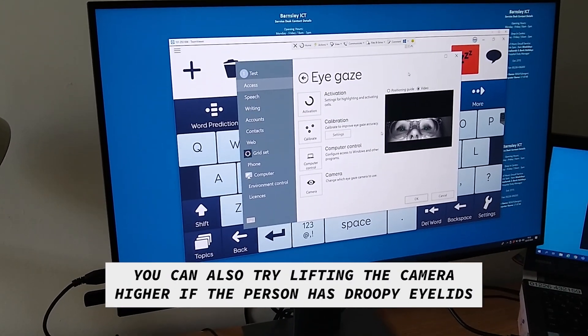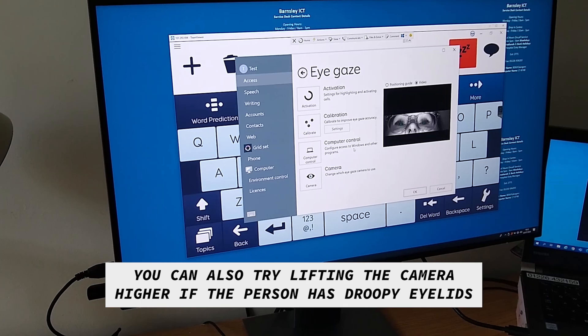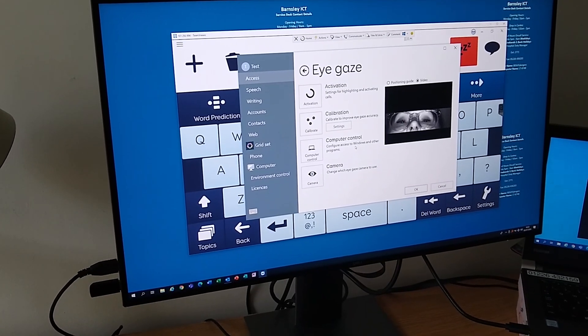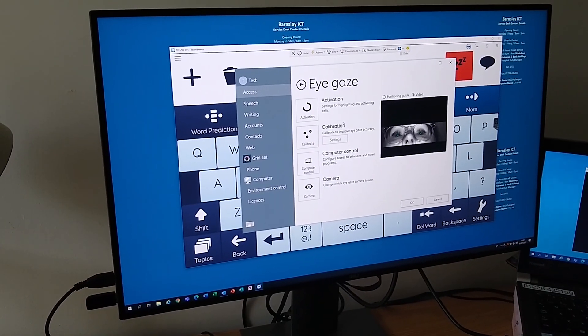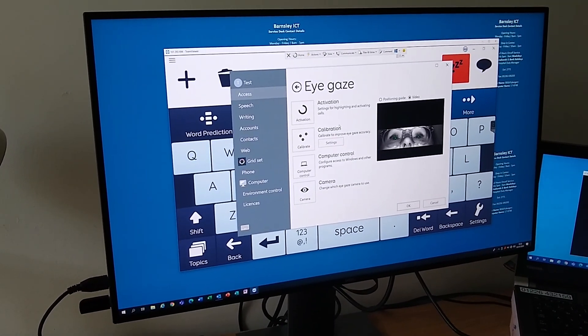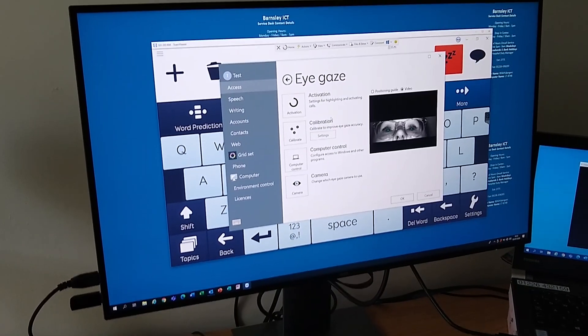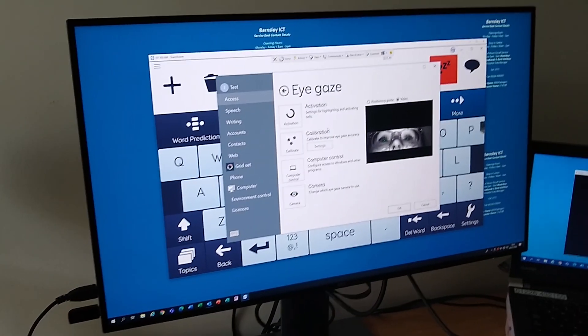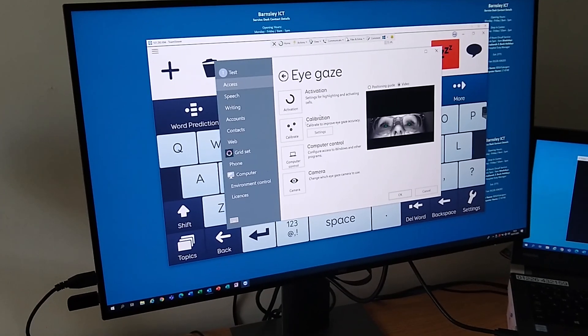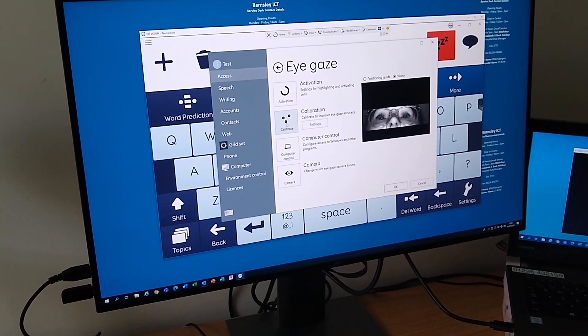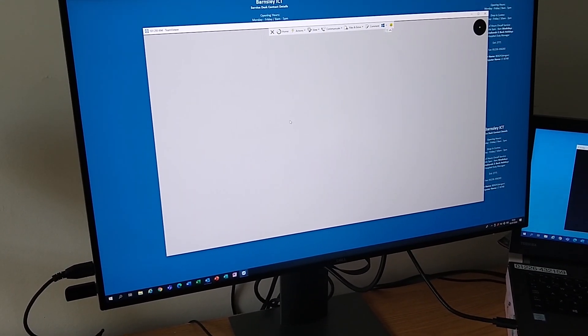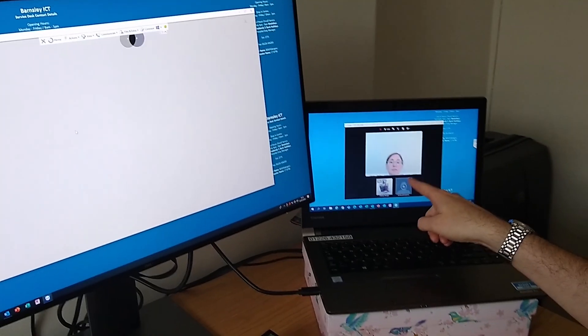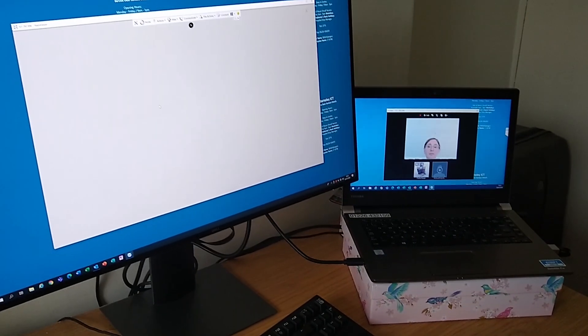Now we have to calibrate the camera to your eyes. If it's all right, Alison, the camera's going to come up with nine points and I just need you to follow them as best you can with your eyes. Okay, we're good to go. In this image over here I can keep an eye on Alison as she's doing this.